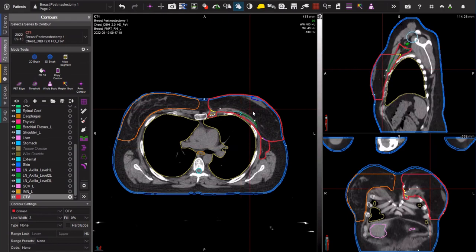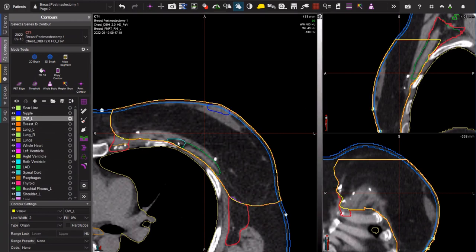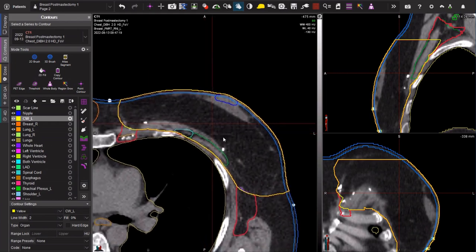You will notice that my chest wall contour shown in yellow is going all the way back to the chest wall. This is what we recommend in post-mastectomy radiation cases. In the post-mastectomy setting, these patients are at higher risk of recurrence and you do want to bring your contour all the way back to the chest wall — behind your pectoralis major and behind your pectoralis minor muscles.